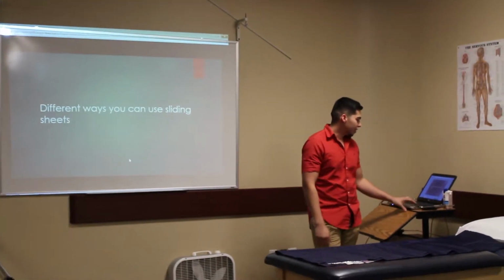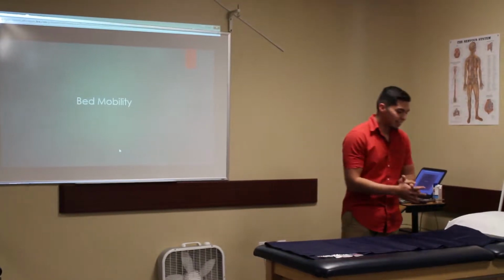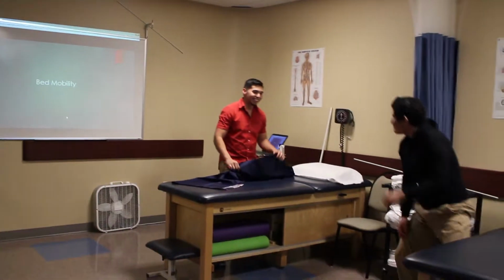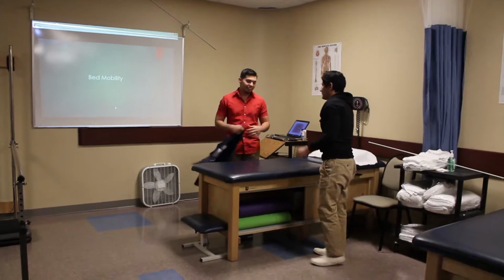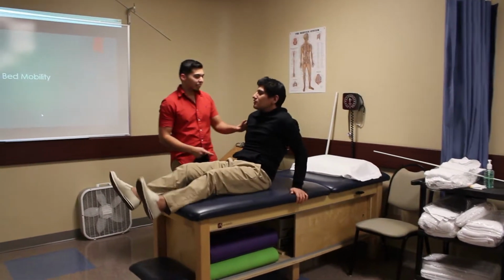So there are different ways you can use the sliding sheets. The first one is for bed mobility. Kevin, I'm going to just step up here. Want me to lie down? Yeah, lie down. Go lower. Right there.